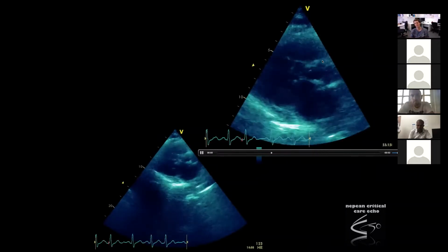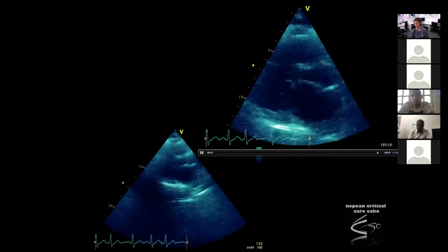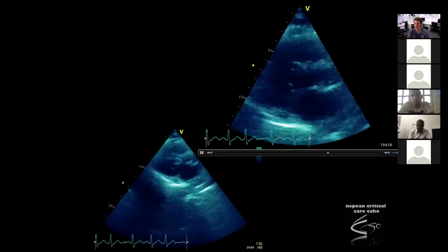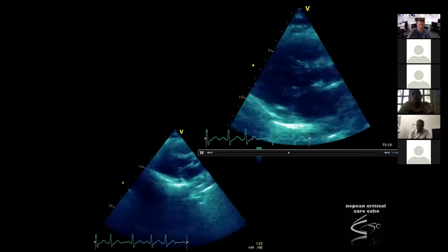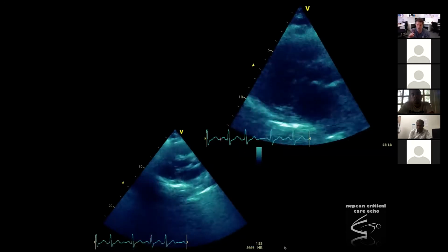But when we went back and spoke to this lady, she was short of breath when she was doing a lot of exercise. When she was mobilizing, going for walks and stuff, she'd get quite short of breath. That was put down to the lung cancer, but maybe it's because she had some relatively mild mitral valve stenosis. When you exercise and you're tachycardic, she's at 120 beats a minute at the moment, you get what's known as functional mitral stenosis.